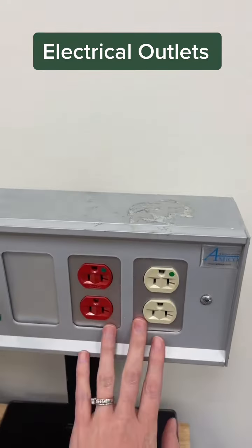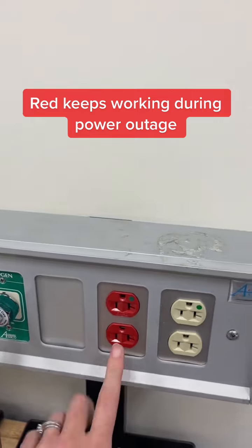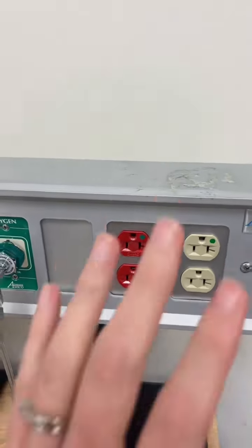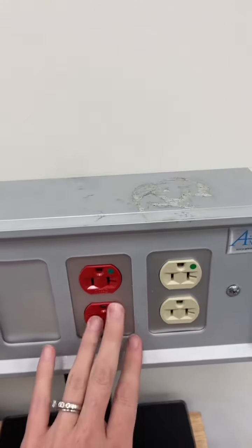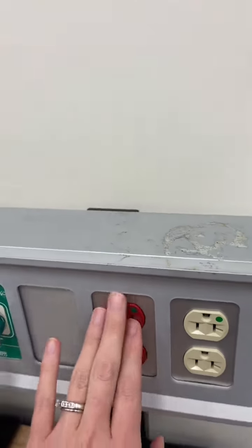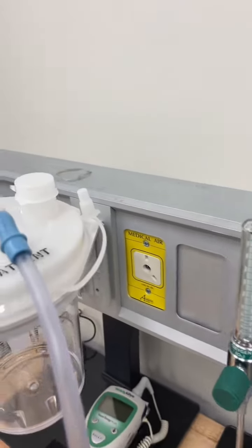Finally, we've got these here. These are obviously regular electrical outlets. The red just essentially means whenever there's a power outage, power will still work here. So you want to naturally connect your more important things to these outlets. There's also the medical air one. I don't know. That's another one I've never used.